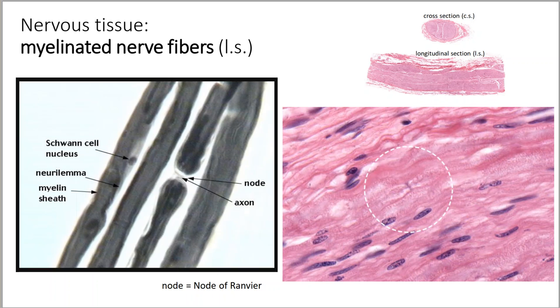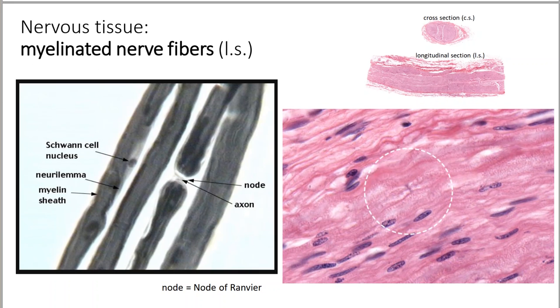Then when you click on that link, you're going to see this picture, this myelinated nerve fiber picture. And what you're seeing is a nerve fiber, right? And you're looking at a bunch of architecture. Your Schwann cell is the helper cell that helps to build up the myelin, and it's going to have a little oval nucleus hanging out next to your neuron fiber. The neurolemma is kind of the plasma membrane of the cell. The myelin sheath is that protein, lipoid substance that serves as insulation.